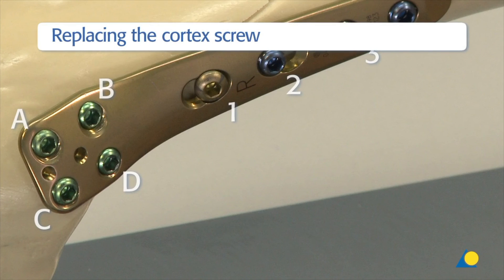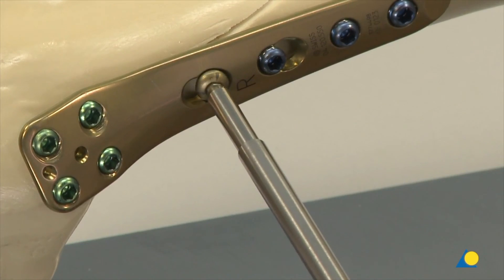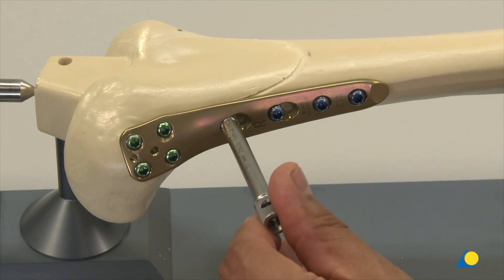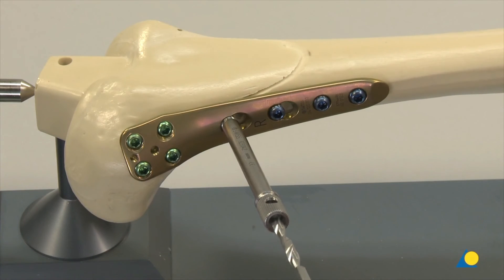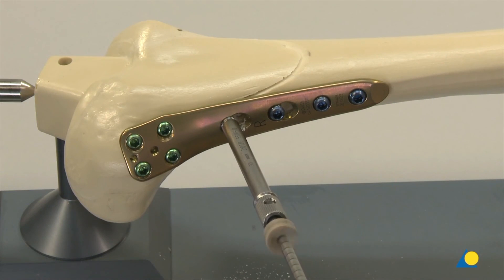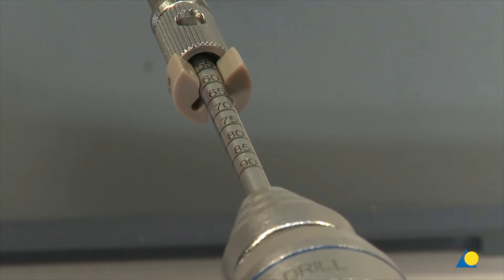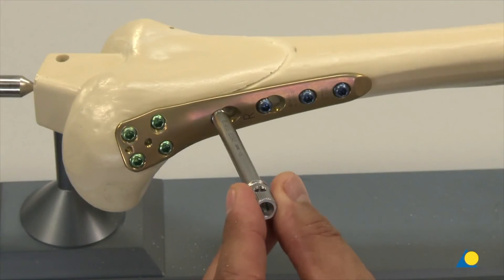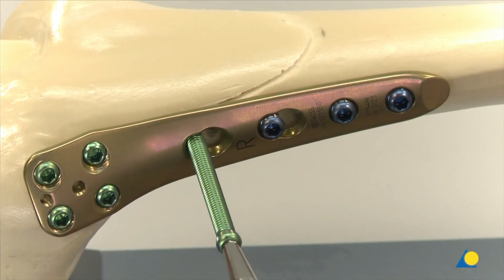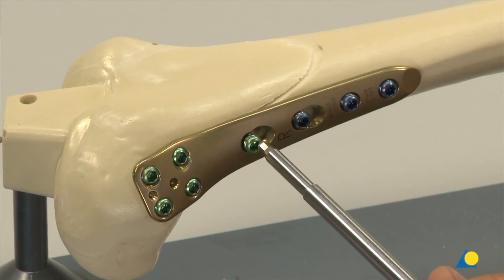The cortex screw is removed from hole 1 to be replaced with a bicortical 5.0 mm locking screw. The LCP drill sleeve is screwed into the threaded part of the combi hole, and the hole is drilled with the 4.3 mm LCP drill bit. The screw length is determined from either the marking on the drill bit or the depth gauge. The locking screw is inserted using a power tool and then tightened by hand with the torque limiter.